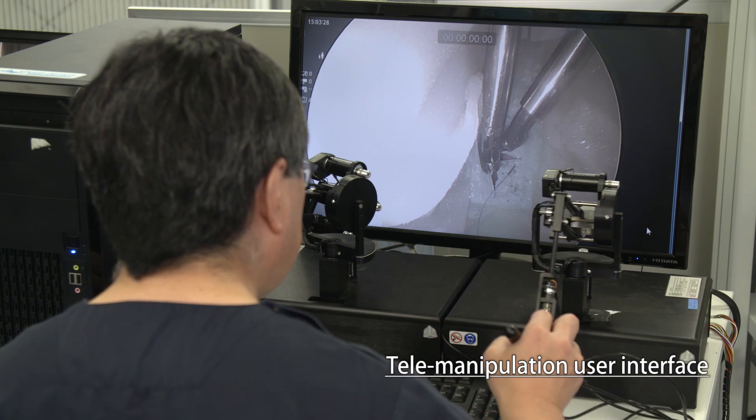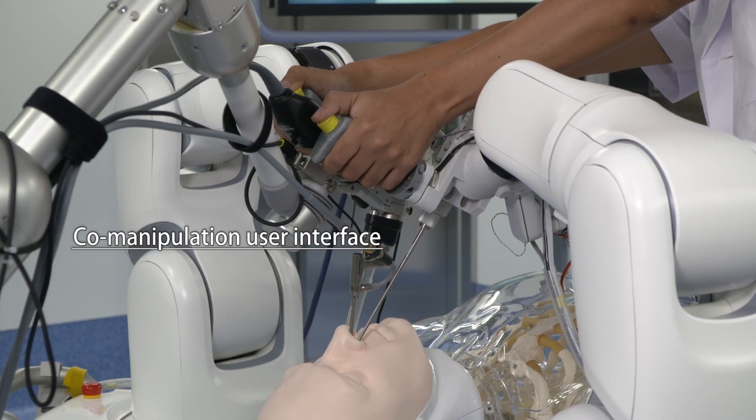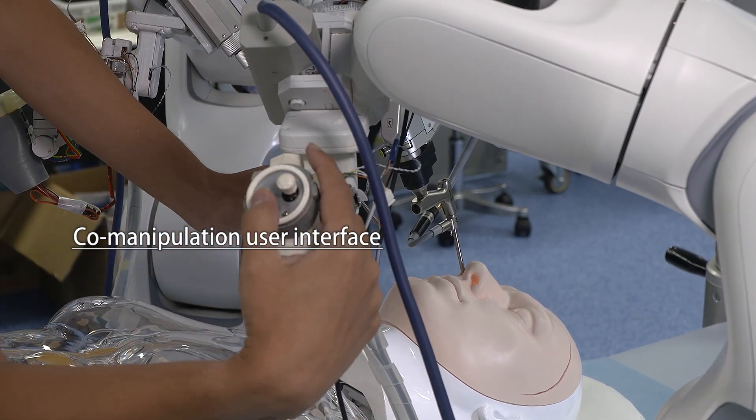As for the user interface, both telemanipulation and co-manipulation types have been developed. Surgeons can choose the user interface depending on the situation.